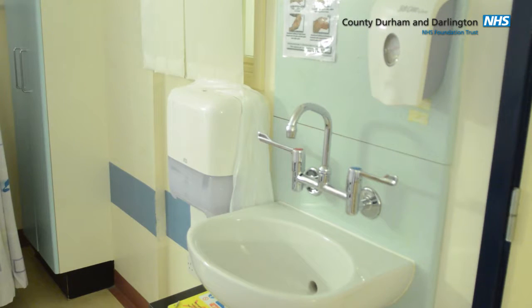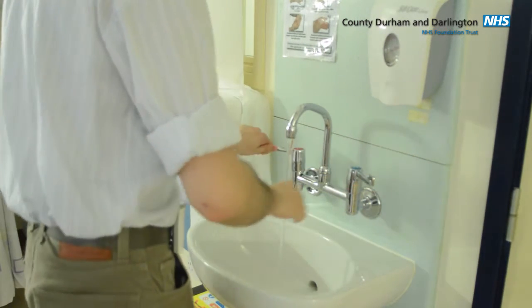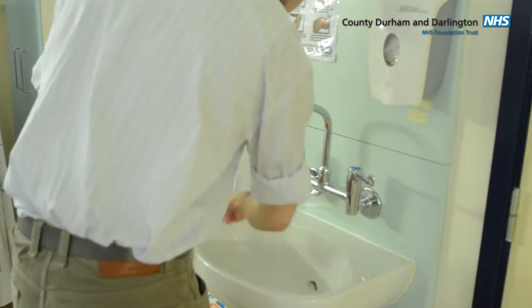Going to wash my hands now. The next step of the procedure is to wash your hands thoroughly in soap and water using the 6-step procedure.